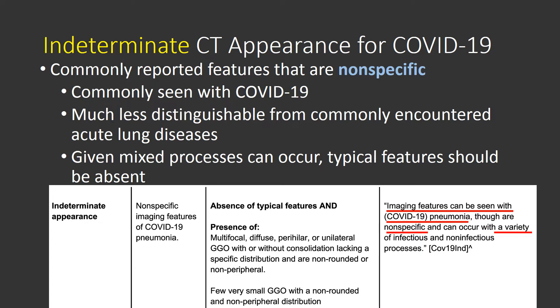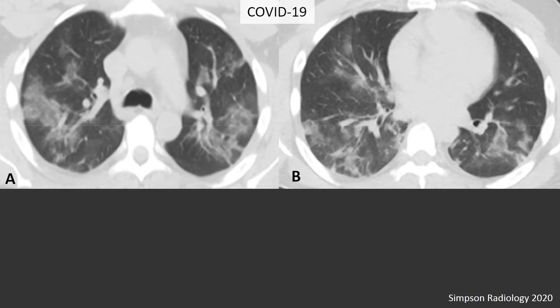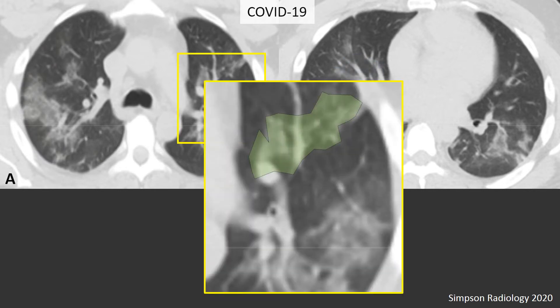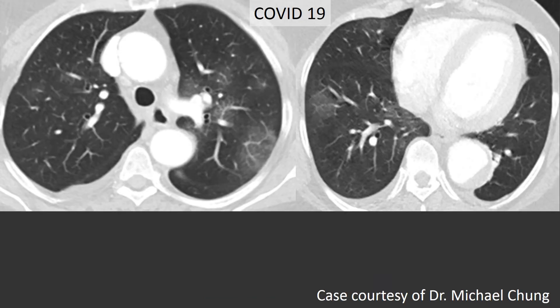Again, COVID-19 is in parentheses. Indeterminate CT features in someone who tested positive for COVID-19 may demonstrate multiple bilateral ground glass opacities without a clear distribution — not clearly peripheral and not clearly central — with a non-rounded morphology. Another case shows patchy bilateral ground glass opacities without a clear rounded morphology and non-peripheral distribution.